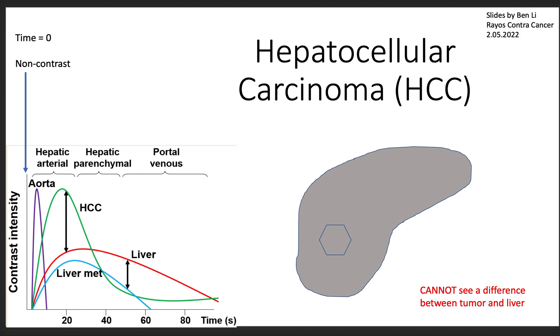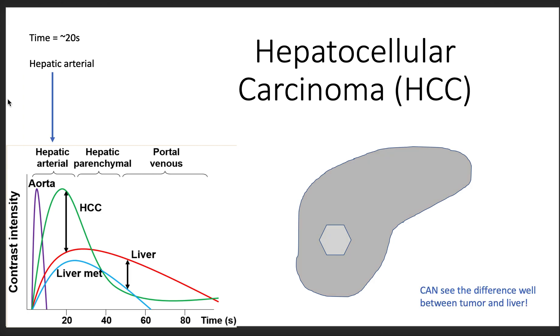We inject IV contrast, and now it begins to flow through our arteries. The first phase is the arterial phase, and we can see that, as expected, the aorta, or the largest artery in the body, fills with the IV contrast during the arterial phase. We see that the liver gets a little bit brighter, and in this case, hepatocellular carcinoma gets very bright. So you can see HCC well on the arterial phase.